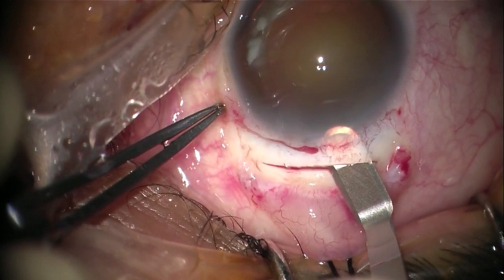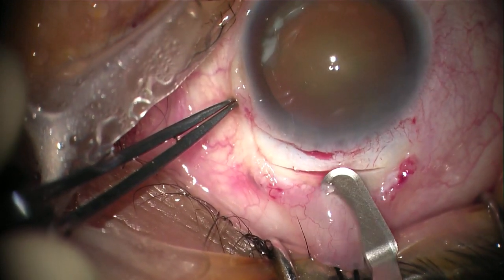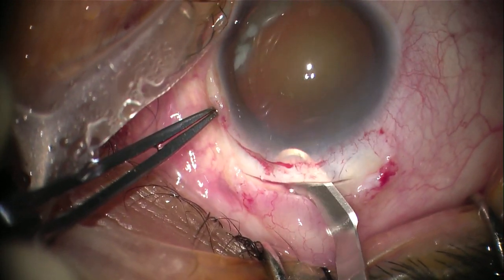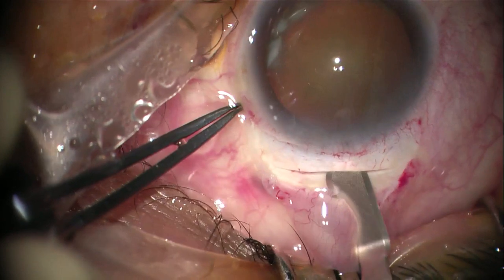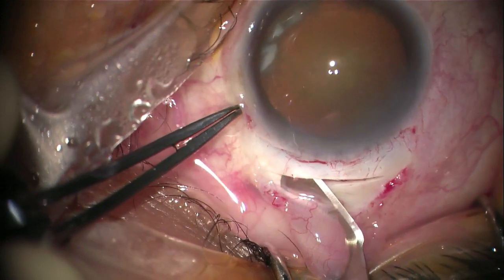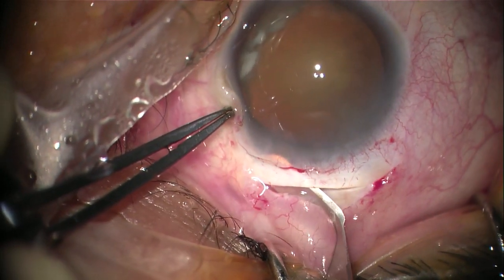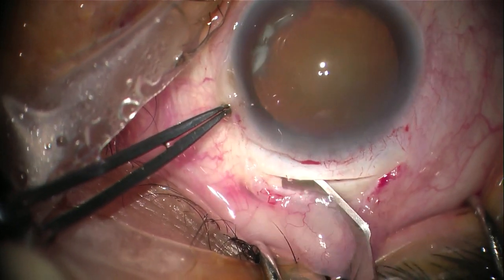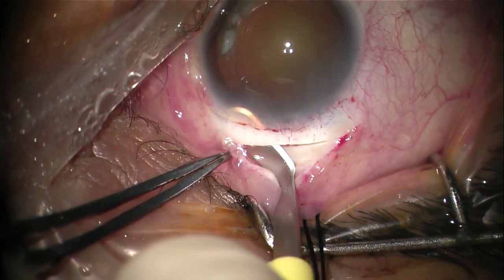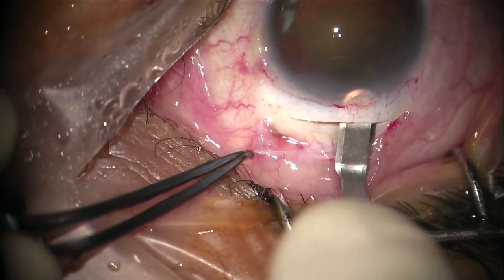Once you are at a good level, proceed with the crescent knife for 2mm into the clear cornea, then extend your tunnel by moving from inside out and not from outside in. This ensures that you stay in the same level and avoids creating multiple levels, which could cause button-holing or premature entry. The tunnel needs to be trapezoid in shape — larger from inside than from the outside — which is important for coaptation of the wound at the end of the surgery.